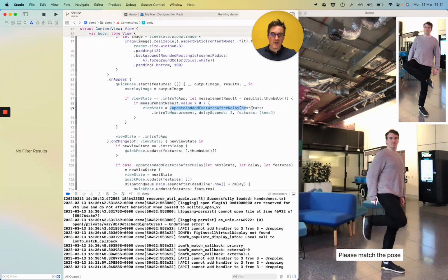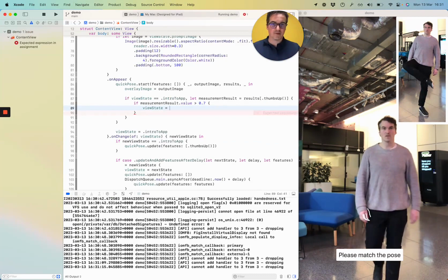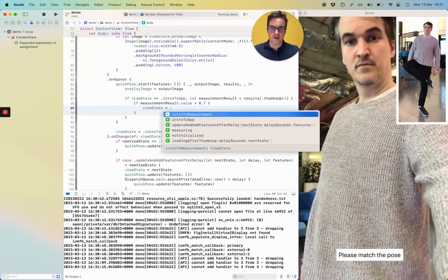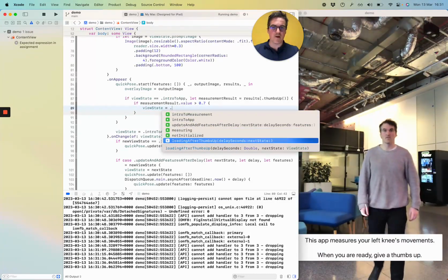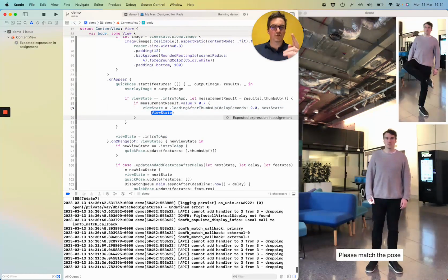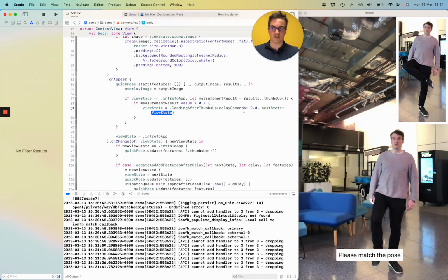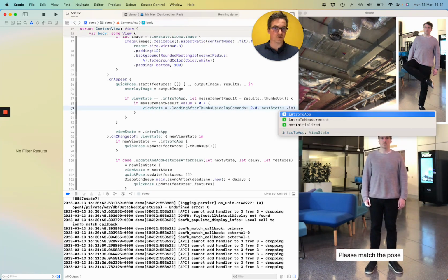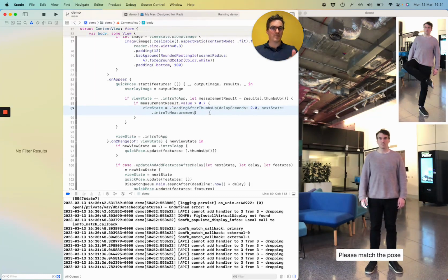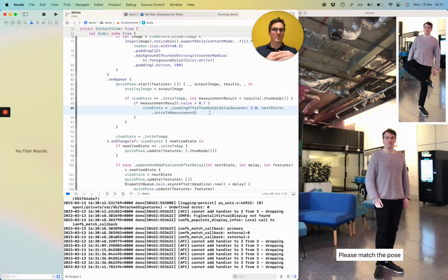So now we're going to change this line to update the view state after the thumbs up. We've talked about the user needing some validation. So after we show that validation, and then after 2 seconds, we're going to move on to a new view state, which is going to be the introduction to measurement. So we're going to give the app intro. We're then going to wait for the thumbs up. Once they've given us their thumbs up, then we jump into the measuring.